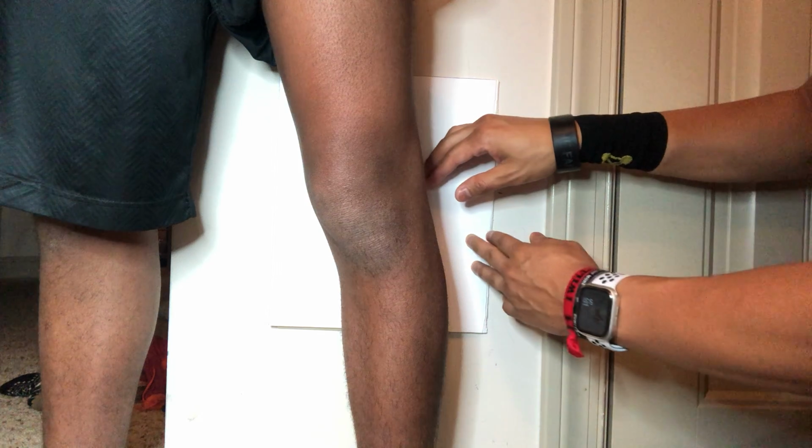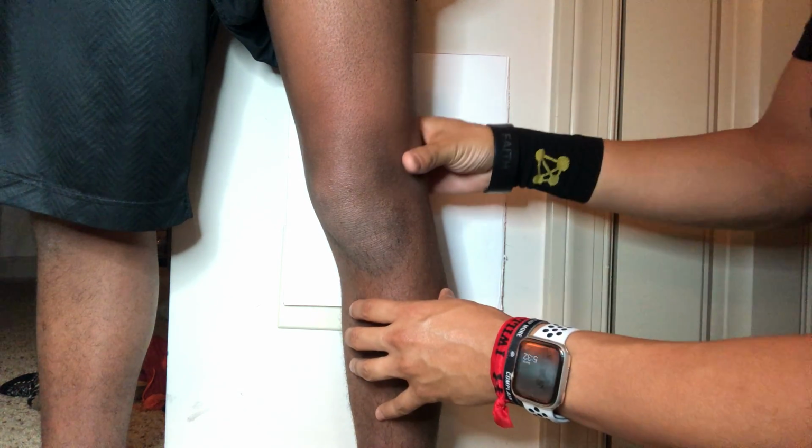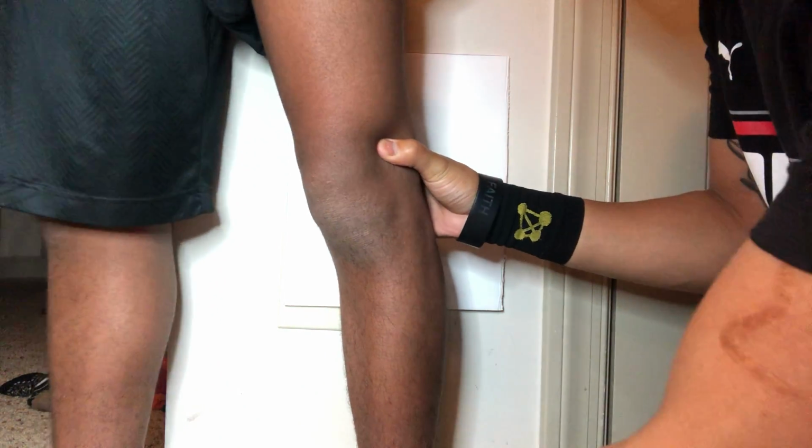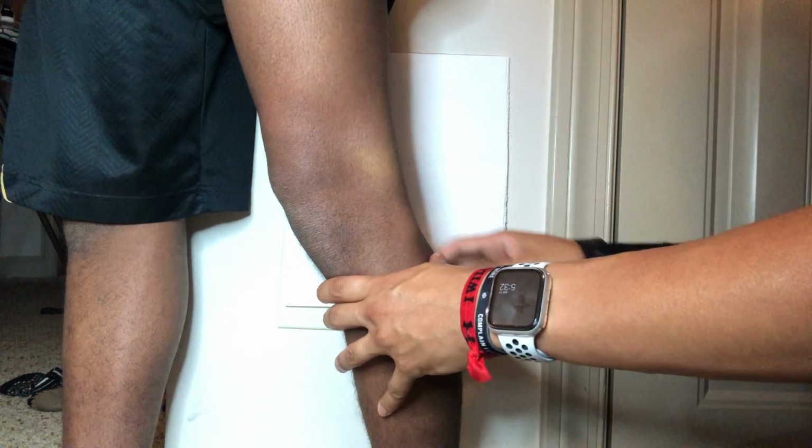Next is going to be the medial oblique knee. It's going to be the same position for the patient, except we're going to have the patient internally rotate 45 degrees. You can keep that leg straight, but we're going to have this one internally rotated 45 degrees.